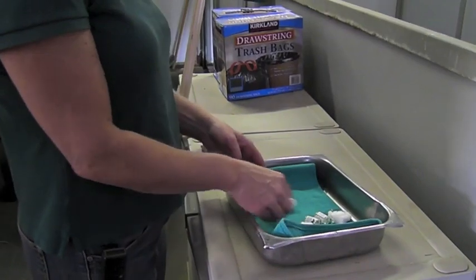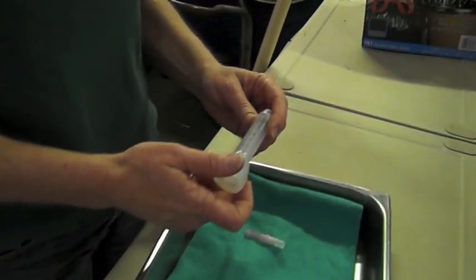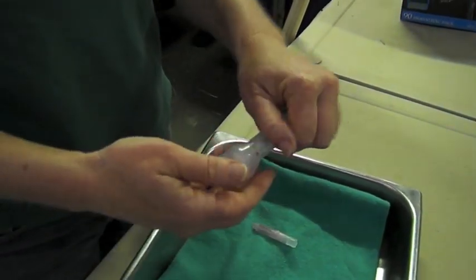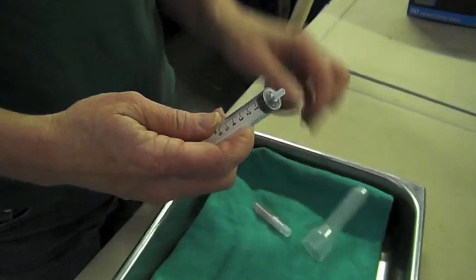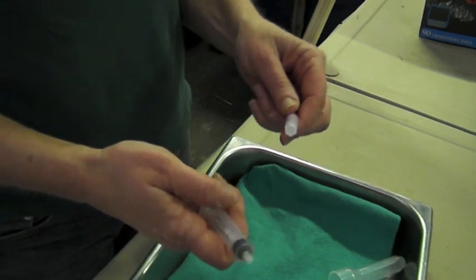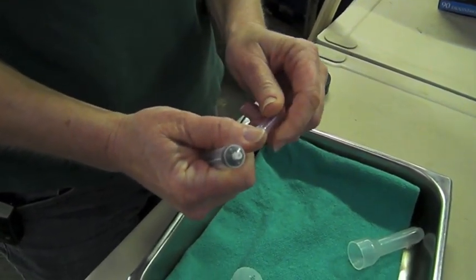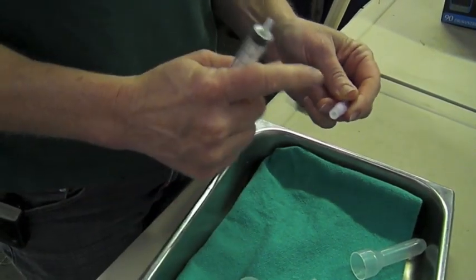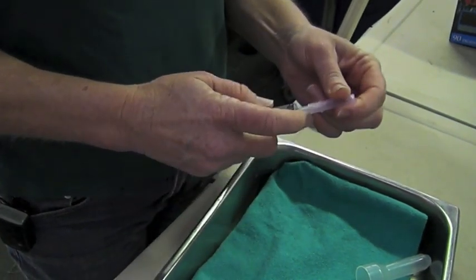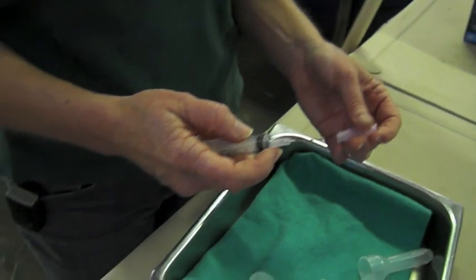Here we have the syringe, needle, and what we're going to give. Let me show you how to open the syringe — right now everything in there is sterile. You just twist the plastic and out it comes. You want to keep that area clean and sterile, so you don't want to touch it. Now you have your needle — same thing, twist. There's a little plastic seal there; pull this off. Now this is the sterile area and you want to put these together. I kind of hold that while I take the cap off, otherwise the whole needle comes off.